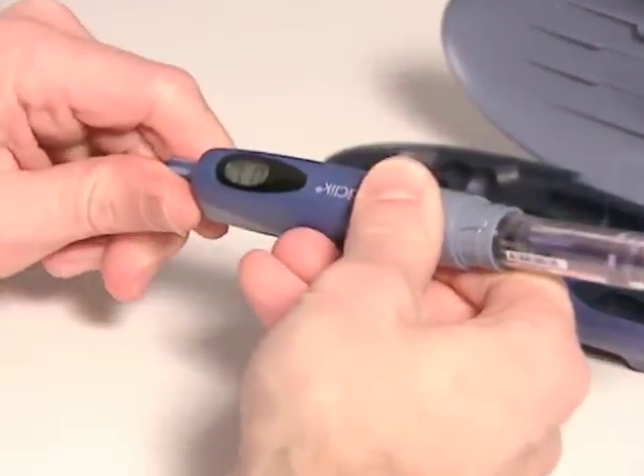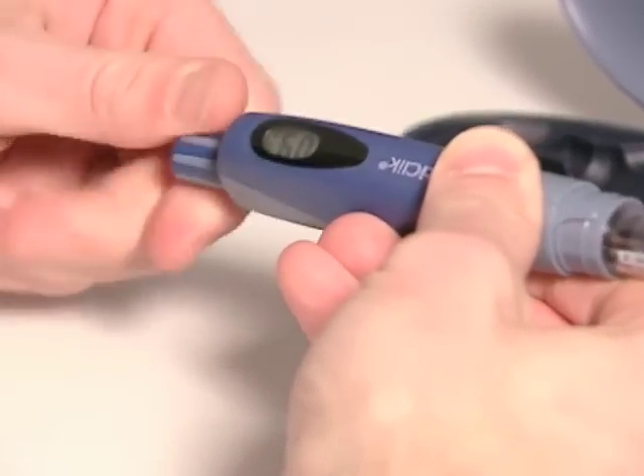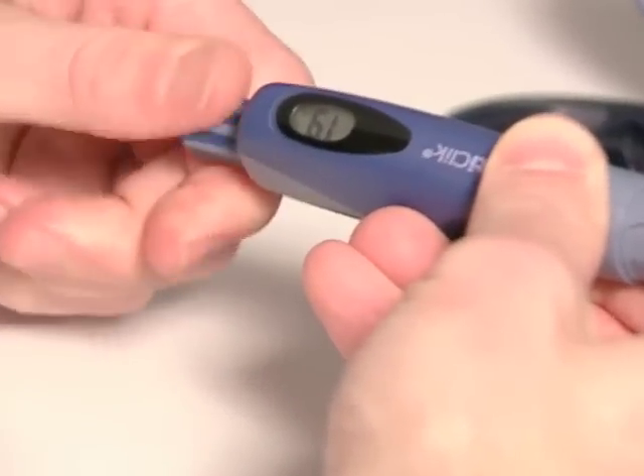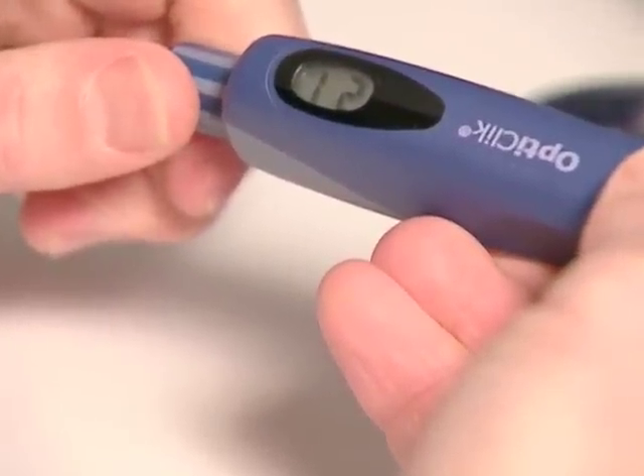Finally, the design of some pens can lead to dosing errors. For example, in some cases the digital display of the dose can be misread if a person holds the pen upside down, as a left-hander might do. In that case, a dose of 21 units looks like 12.